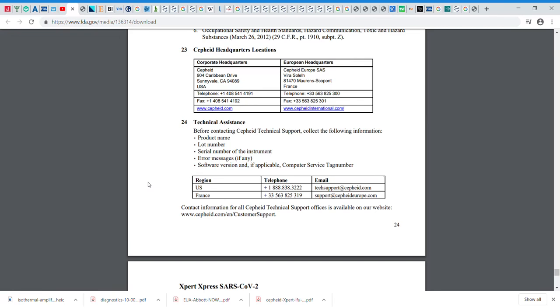So I think the idea is, what makes a good test? First of all, you have to know what kind of test it is. So PCR versus other things. But the gold standard is still this NAAT, nucleic acid amplification, because you're testing for the actual presence of the RNA of the virus, its genetic code. And you think, well, if that's present, then it's good. But first of all, you have to make sure you extract it, because it's hidden inside, right? If it's inside, then it's no good. Your probe is not going to reach it if it's still hidden inside a lot of different proteins. So you've got to figure out some way of extracting it first. But presuming that works well, then if you have the presence of that material, even a very low amount, because we're able to amplify so much, we catch such low levels, then we think we got it.